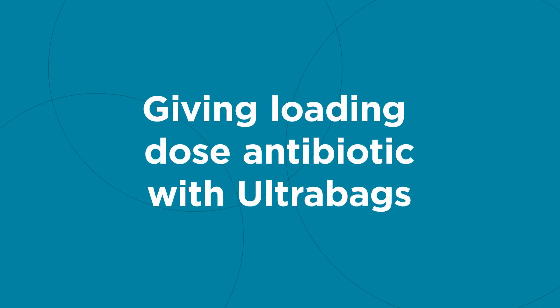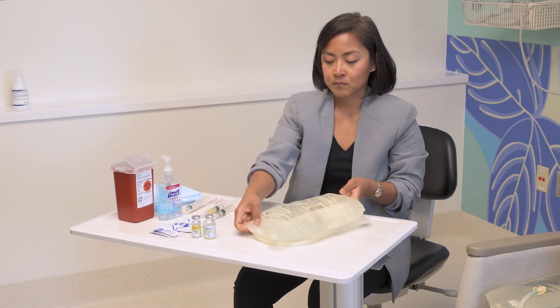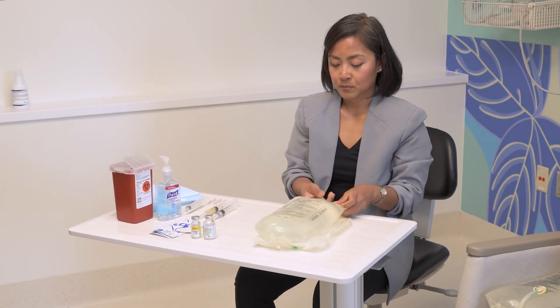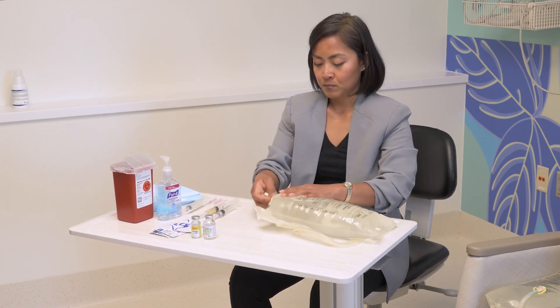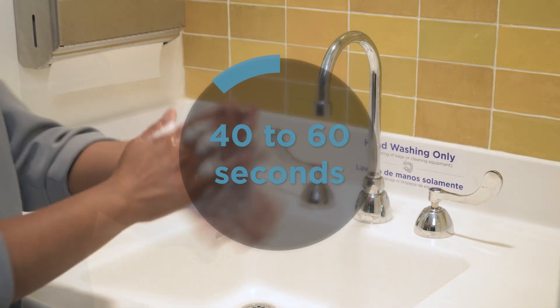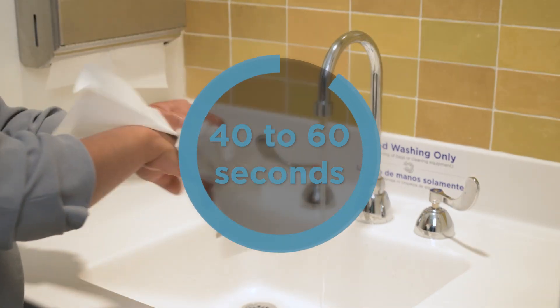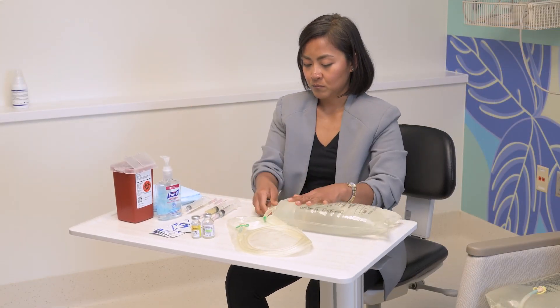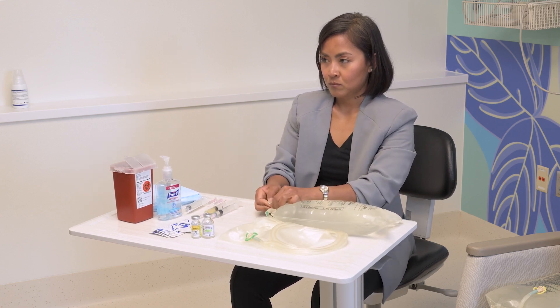Giving a loading dose antibiotic with ultra bags. When a person is put on antibiotics, the first dose is called the loading dose. Most often, this dose is given at Seattle Children's by a dialysis nurse. If you are instructed to give it at home, here are the steps: wash hands for 40 seconds to one minute. First, flush your child's peritoneal cavity using an ultra bag. To understand this process, review the manual PD video.